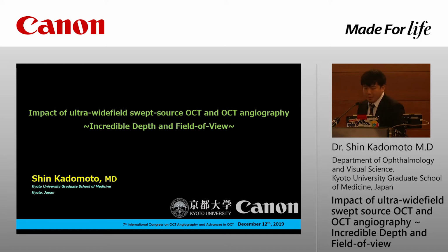Well, maybe one of the most powerful driving forces for all ophthalmologists is a desire to fully visualize and evaluate the whole eye fundus. This is considered an essential requirement to ensure the realization of high quality medical care, but how can we do it?